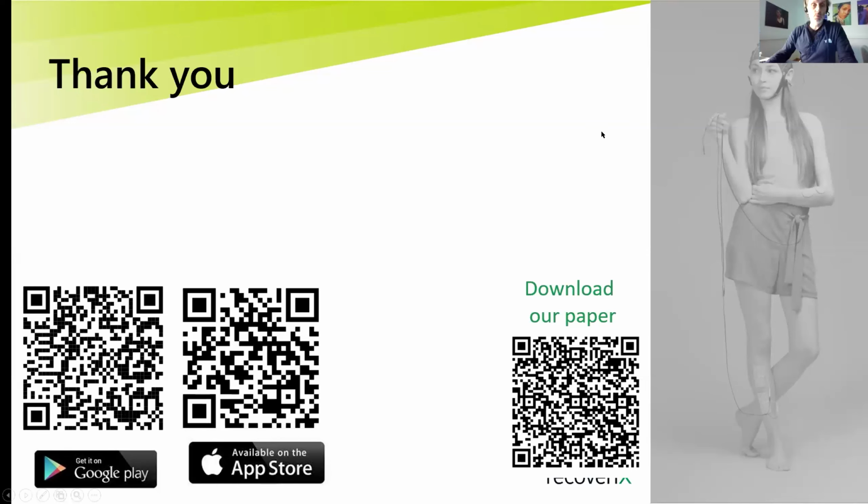Robert Manuel wants to know if the fluctuating audience, more and less people depending on accuracy, is good because it's also a kind of punishment, and shouldn't you always motivate patients? Yeah, we discussed it, and we also asked some patients. So in general, they're happy because all people or almost all people like a challenge and they know it's a game. So they see it really as a challenge: I want more people here.